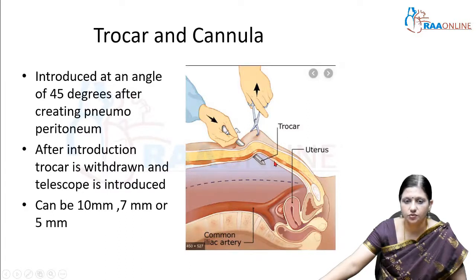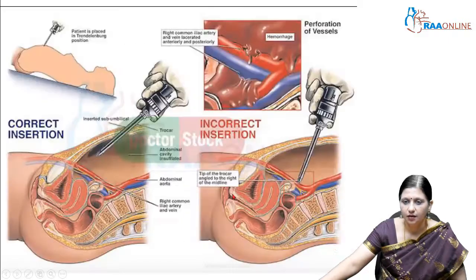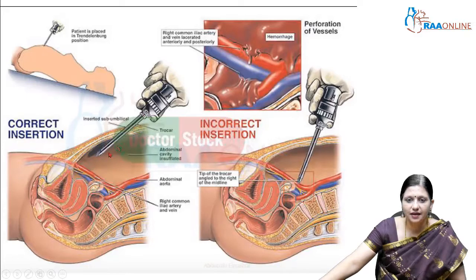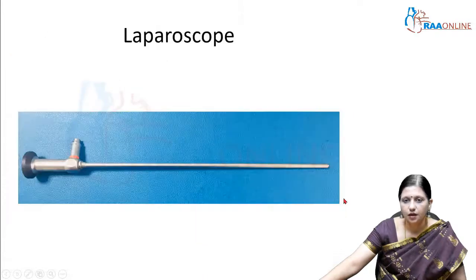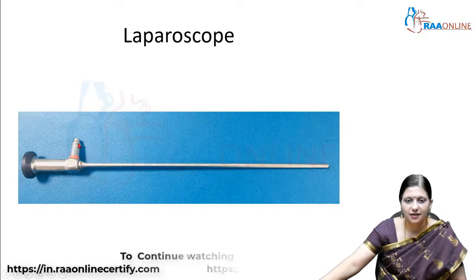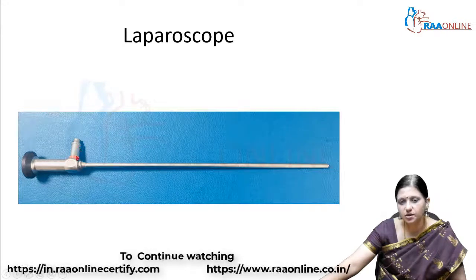We have various sizes: 10mm, 7mm, or 5mm. The correct insertion method is at an angle of 45 degrees — if we were to insert it directly without making an angle, we can injure the vessels, which can lead to torrential hemorrhage. Coming to the laparoscope, this is a Karl Storz variety. This goes to the video monitor and this goes to the light source. It has an angle of 30 degrees and uses a rod lens system.